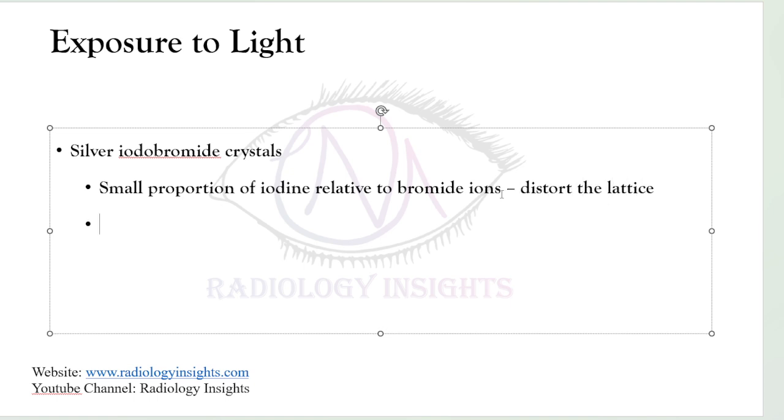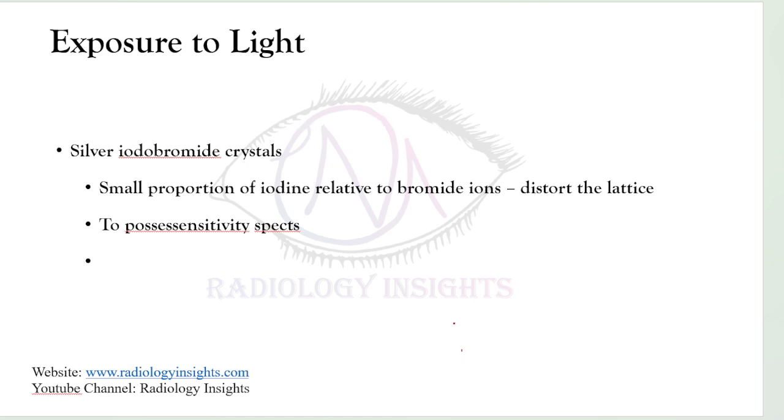The silver halide crystals are manufactured to possess sensitivity specks on the surface. So on these crystals, you will see a photosensitivity speck.